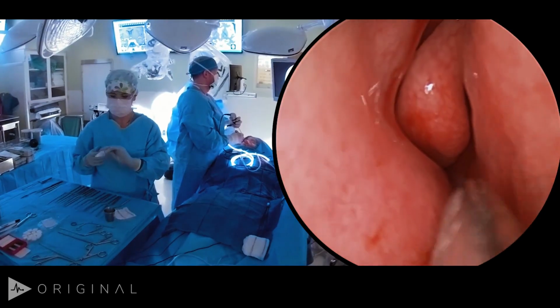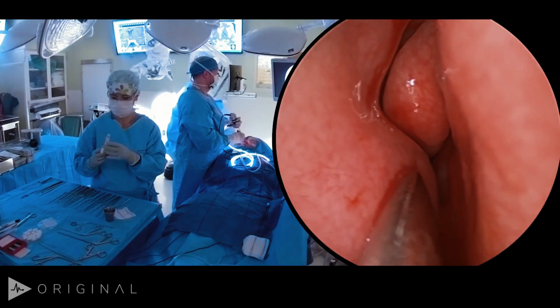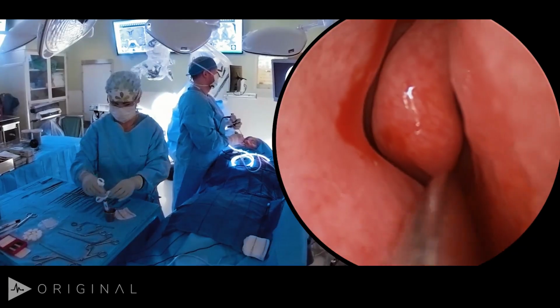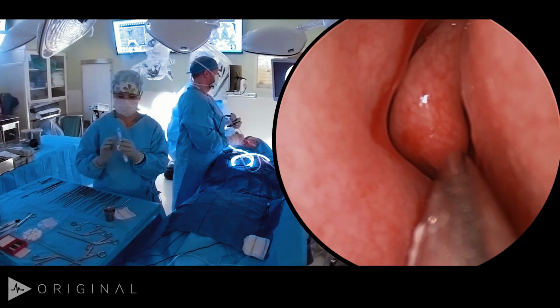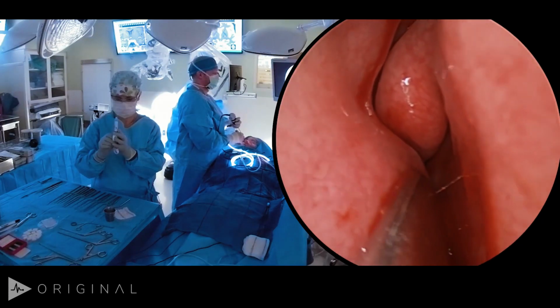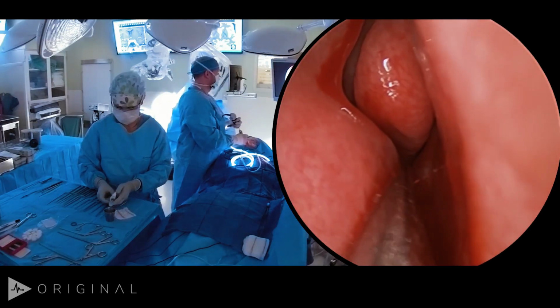You want to make sure that you have adequate exposure and access to get back to the sphenoid os. And that's going to be medial and posterior to this. We're going to have to kind of lateralize the inferior turbinate and gently lateralize the middle turbinate, keeping in mind that it's attached to the skull base, so you don't want to forcefully fracture it over. Once you identify your superior turbinate in the back, then the sphenoid os should be medial to that. Once you identify your sphenoid os and open that, that'll give you access to the subsequent steps of your surgery.